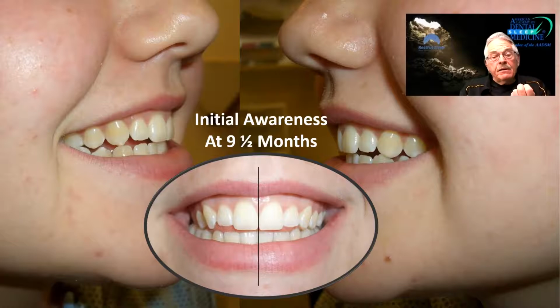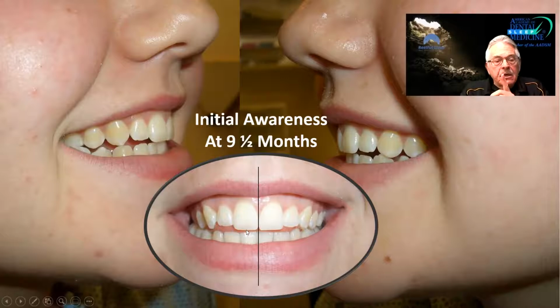So I had buy-in from mom and the patient, and now, lo and behold, here we are 9.5 months later. I don't really bother to take pre-delivery NTI appliance pictures. I should probably, but I've just done this so long that it just happens sometimes, and I accept that. So here we are 9.5 months later, and we have an anterior open bite. Keep in mind, this patient has not been on meds for 9.5 months, okay? Trust me, I got buy-in from this 18-year-old, okay? I certainly have buy-in from mom.